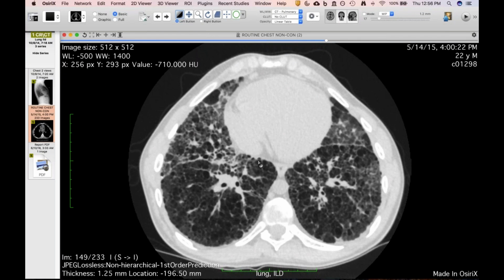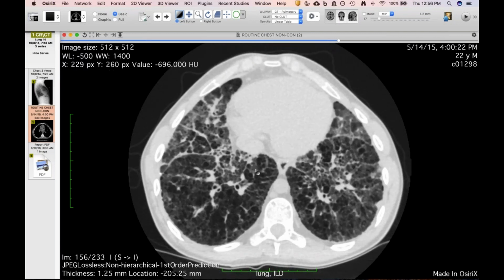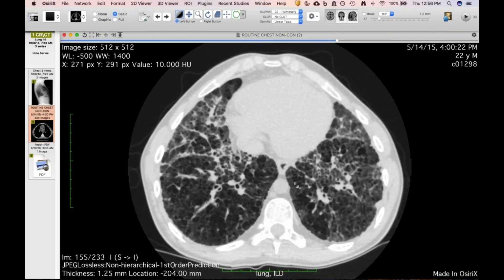And I think part of the problem too is that when I read it, it was predominantly pediatric radiologists who were supporting it, and the terminology that they were using was not Fleischner terminology. They would go reticular opacity with microcystic change, you know? Yeah, right. And we all know what that means. Yeah, exactly.